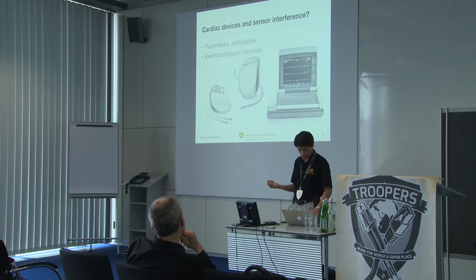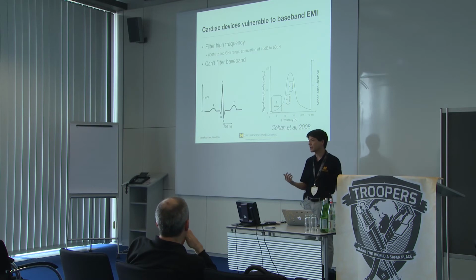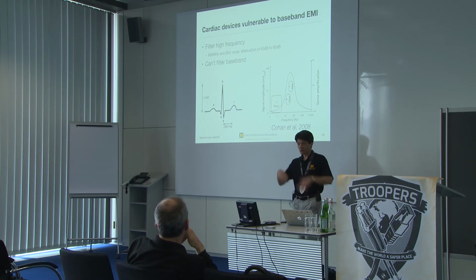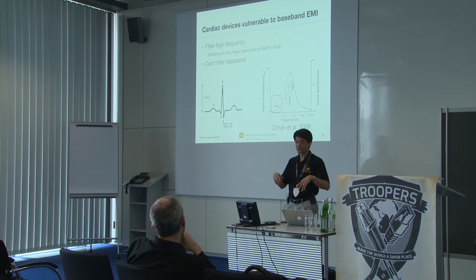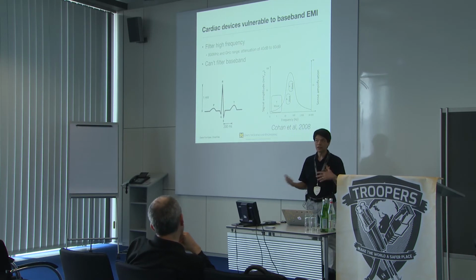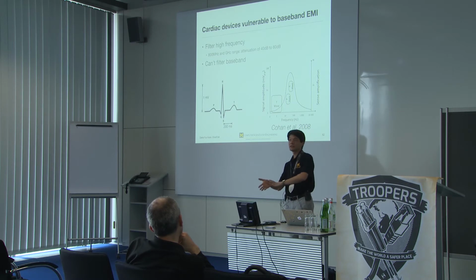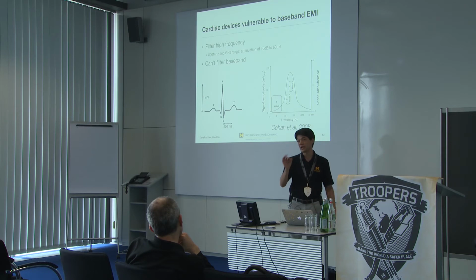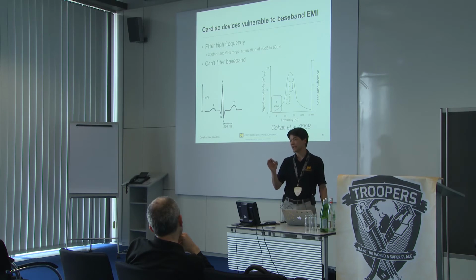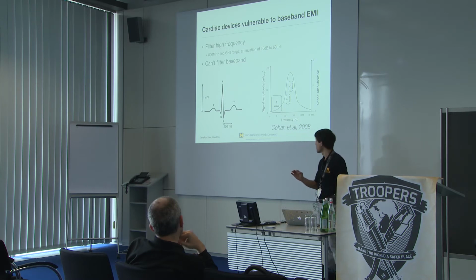What we discovered is that we can create specially crafted electromagnetic interference. You've probably all heard things like don't walk near a high tension power line with a certain kind of medical device that could interfere. That's accidental interference. If you can create specially crafted interference such that the medical device demodulates it in a chosen way, you can actually command that device what bits it sees on the analog to digital converter. So let me explain how that's done.